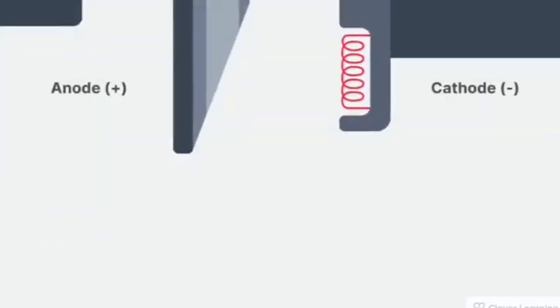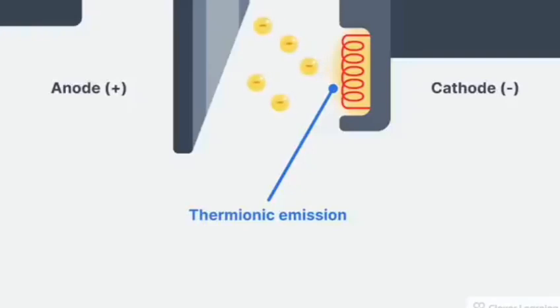Electrons are produced in the X-ray tube at the cathode filament. The specific process is called thermionic emission, which is the release of electrons in response to heat. A current running through the filament causes it to become extremely hot, so hot that electrons are actually dissociated from the metal and form an electron cloud around the filament. This is kind of like the filament in an incandescent light bulb. A current running through the light filament creates heat, which creates light. In an X-ray tube, the filament gets so hot it creates free electrons.